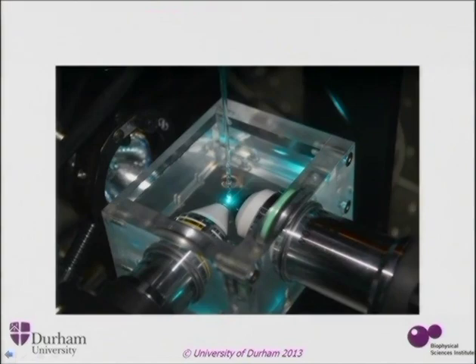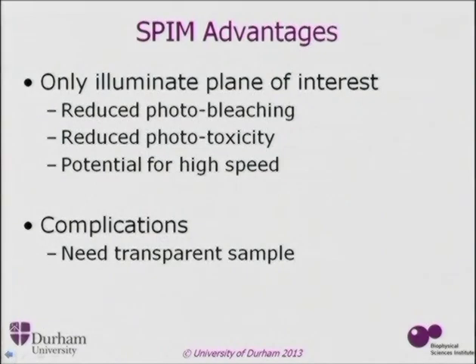And this is what it looks like. Here you can just about see the sheet of light going across. Our zebrafish is in this tube, a pipette mounted vertically, and we anesthetize the zebrafish, and then the imaging takes place along this line. And we can keep the zebrafish, they're quite happy, they develop quite normally. We've done it for over 72 hours, held while we've been doing this, not imaging all the time.